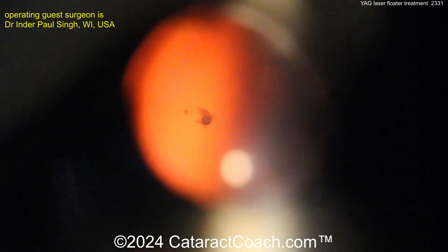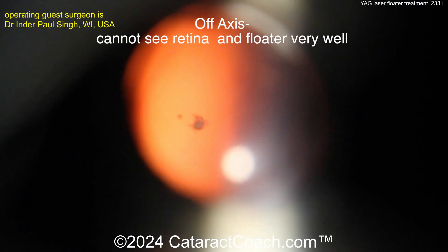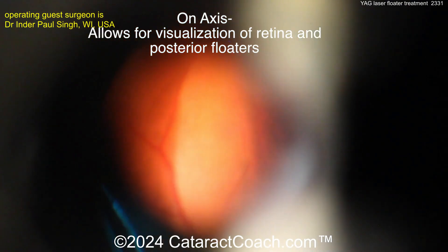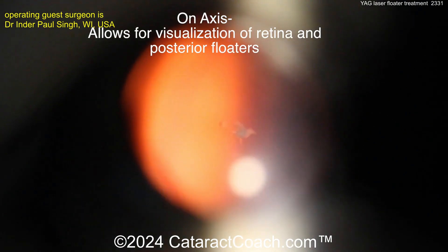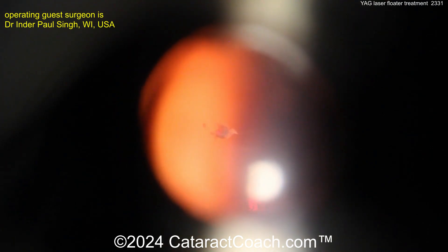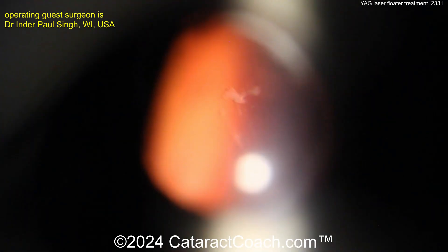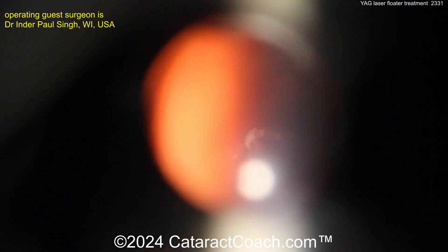You can see off-axis, then on-axis — we're far enough away from the nerve, there's the retina, there's the lens, and here's the floater. Good, don't move. You'll hear some clicking sounds — this is normal, no worries. Here we go. Look — a hair to your right. There you go.